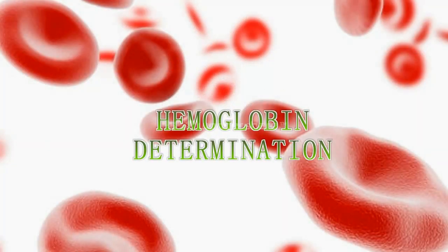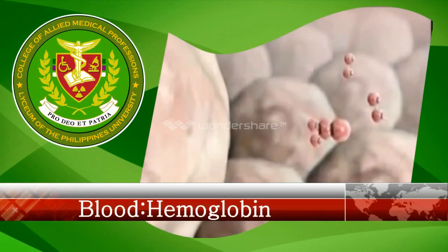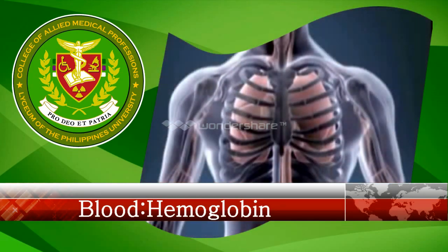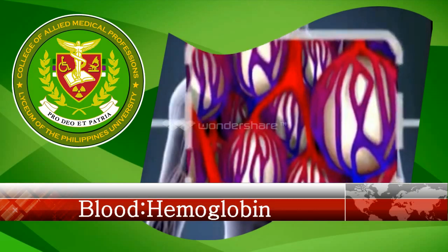Hemoglobin determination. Our objectives for this experiment are to perform the hemoglobin procedure satisfactorily and to determine the hemoglobin concentration in the patient sample.